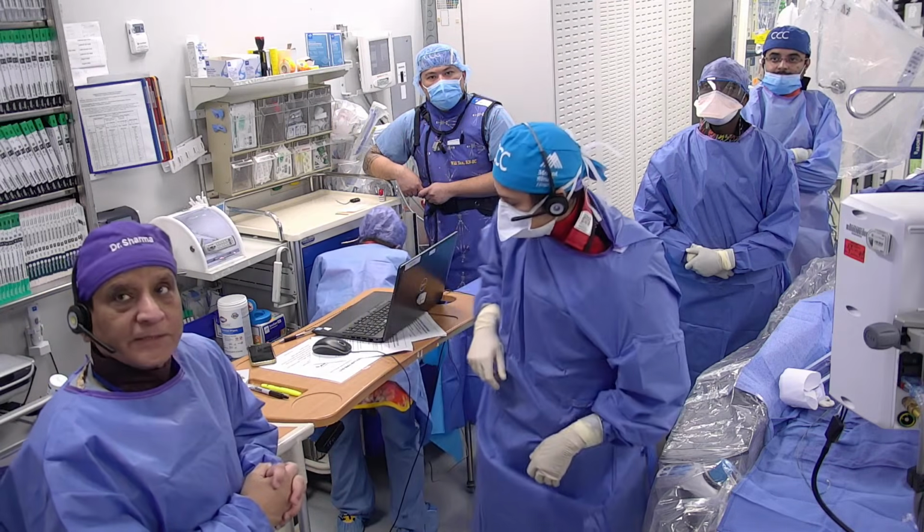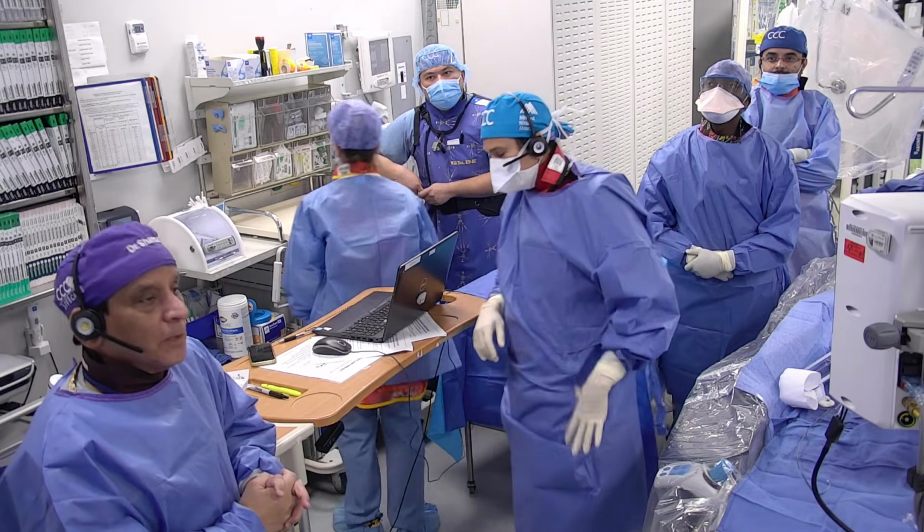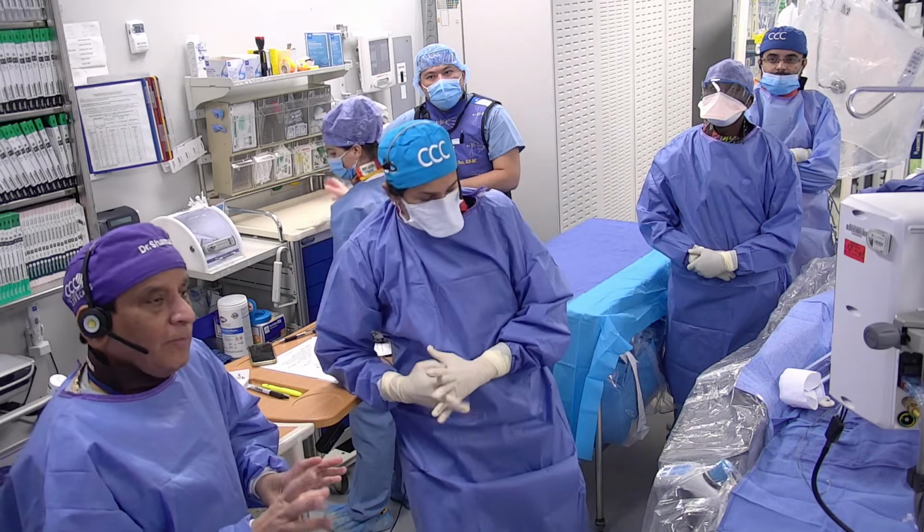The leaflets. Yeah, because of the pump. So the answer is do not practice; use a balloon pump in those cases.